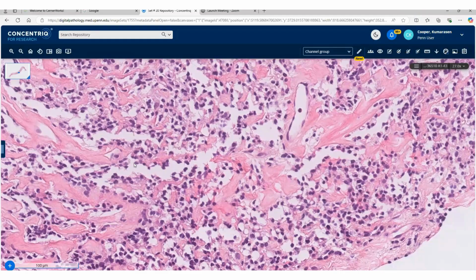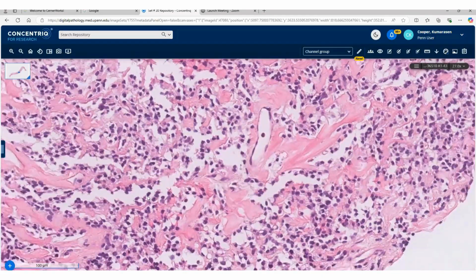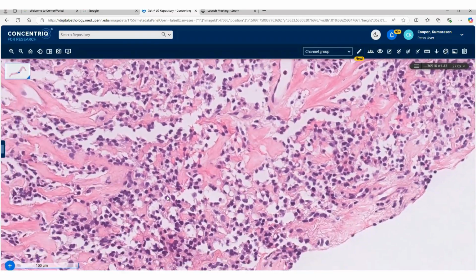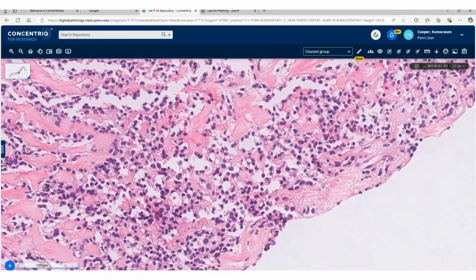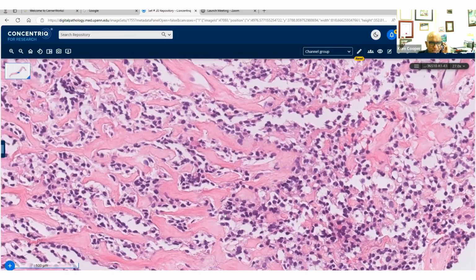Dr. Cooper, so all the other differentials you mentioned, will you see such a consistent arrangement of the cells, the clear change and the stroma, and the vessels? Will they have the same arrangements? Because this is very consistent from field to field. That's very true. That's correct.